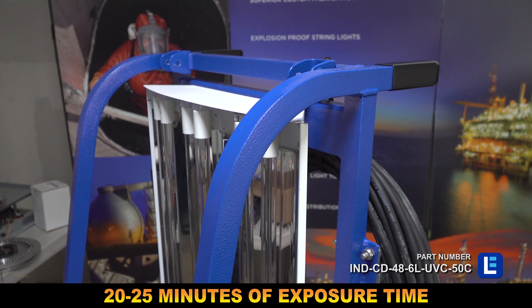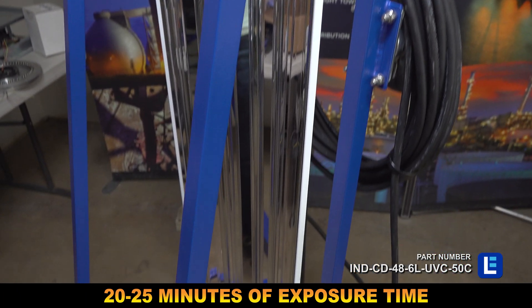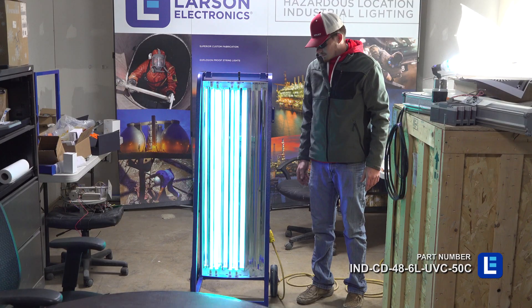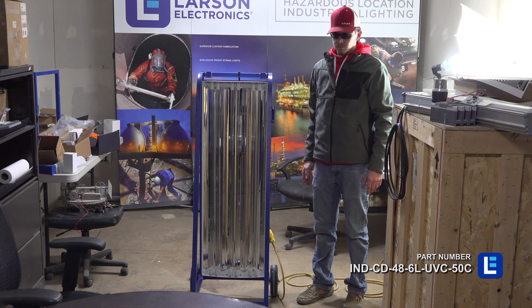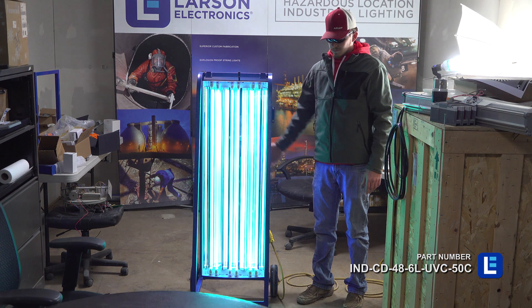With a recommended 20 to 25 minute exposure time for viruses, multiple carts can be purchased to cover larger areas more quickly. This light cart has an automatic timer that will run the UVC light for 30 minutes. It also has a built-in motion sensor. When motion is detected, the unit will automatically shut off for 30 seconds before resuming cleaning.